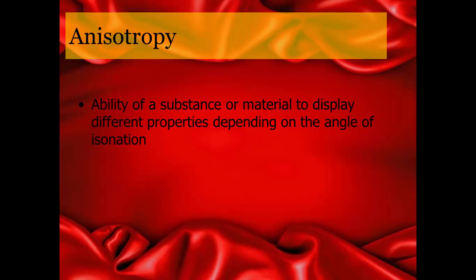So in the case of MSK imaging, tendons are the strongest anisotropic reflectors, but muscles, ligaments, and nerves demonstrate anisotropic properties as well. This artifact rears its ugly head when a highly reflective structure, like a tendon, appears hypoechoic rather than hyperechoic, because the incident sound beam is less or greater than 90 degrees to the tendon.